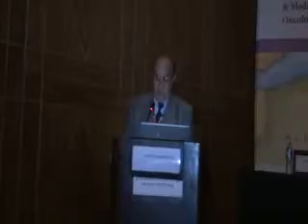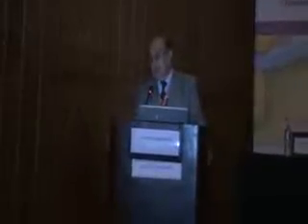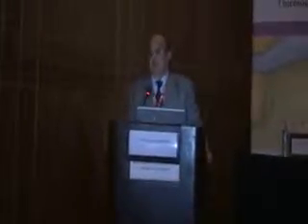invented devices in order to be sure that you are hitting the correct and the planned PTV. So that is the most important thing, and this is the key for the success of your treatment. I wrote here, no IMRT without IGRT. I always put this slide, and this is a message to everybody. There is no IMRT without IGRT.